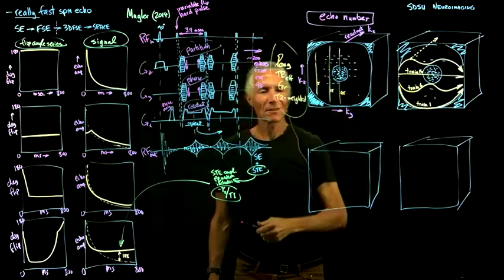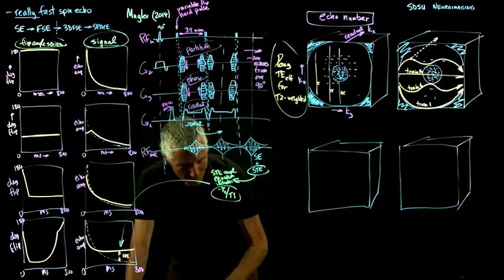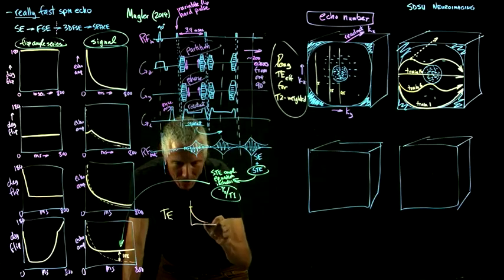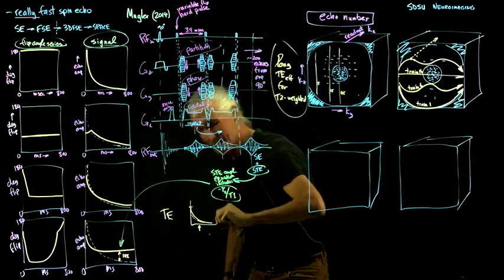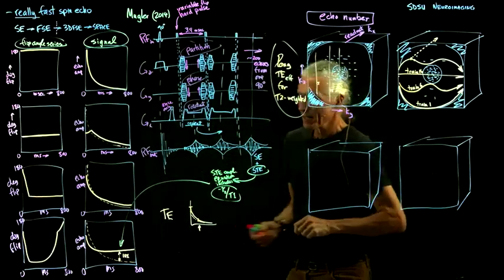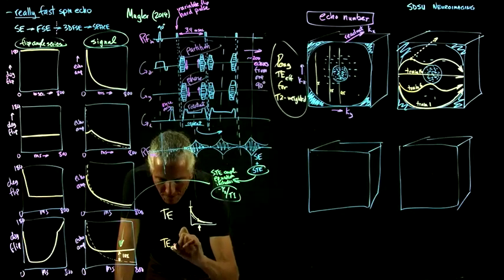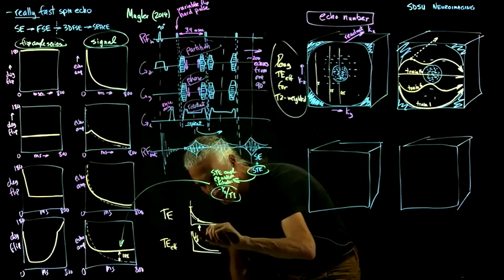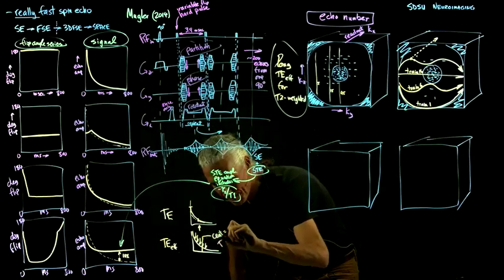And this is sort of doubly TE effective. So we started off with TE. So what is TE? TE was, we record the signal at some point right here, and we hopefully get a contrast difference between the two. But then we said, well, when we have fast spin echo, what we do is we have TE effective. And what is TE effective? TE effective is whatever the time that you recorded the center of k-space. And so in TE effective, here's the thing falling off, and you're recording all over the place like that. But you record the center of k-space. The center equals what you call TE effective.